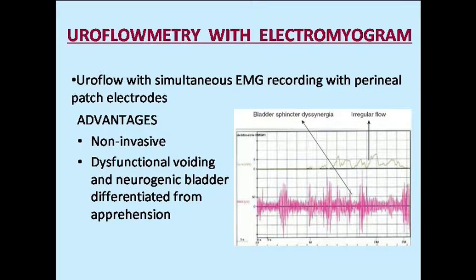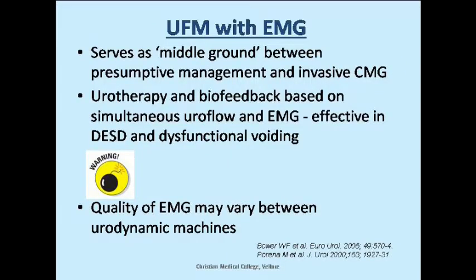Recently, this is getting popularized, especially for pediatric children, because you can get a surface electrode EMG done, and so-called dysfunctional voiders, or problems with pelvic floor activity, can be picked up. I must admit that I usually do not do EMGs in my routine adult clinical practice. I'm not very happy with them. I personally get very impressed when I see book pictures of fantastic EMG traces.